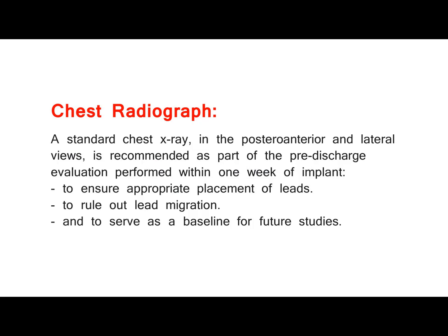Chest radiograph. A standard chest X-ray, in the postero-anterior and lateral views, is recommended as part of the pre-discharge evaluation performed within 1 week of implant. To ensure appropriate placement of leads. To rule out lead migration. And to serve as a baseline for future studies.